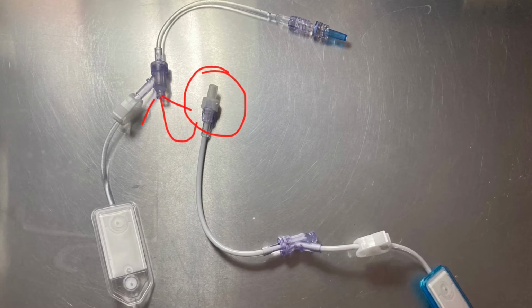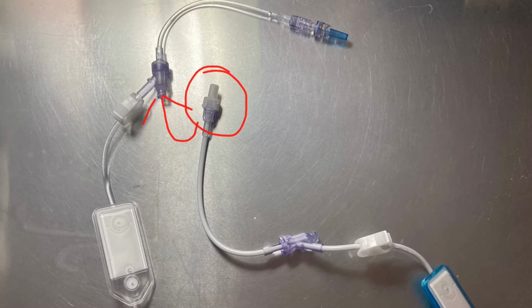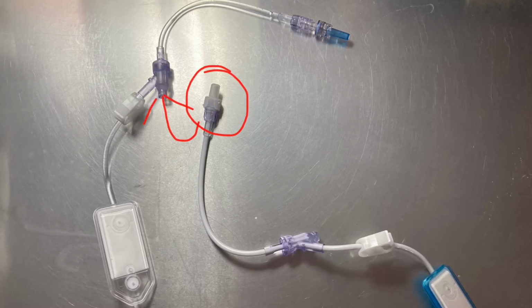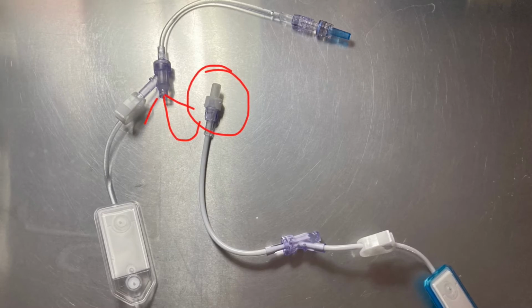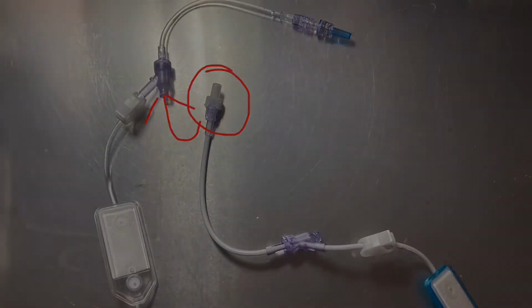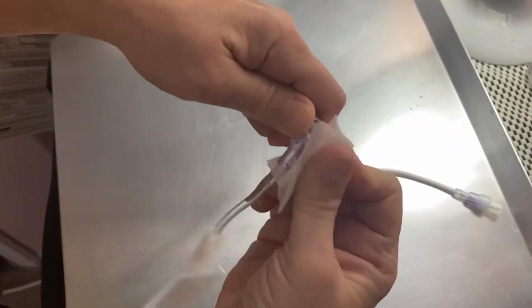You're going to connect the lipids line into the TPN line, as you can see from the picture, not the other way around. It has to be like this because the TPN line, which has the clear filter, is a little bigger and lets both TPN and lipids run through it at the same time. Just after the clear filter, you will scrub the connector piece for 15 seconds.